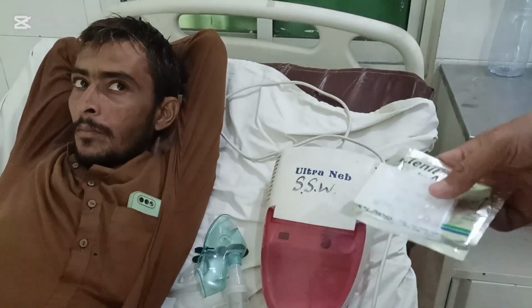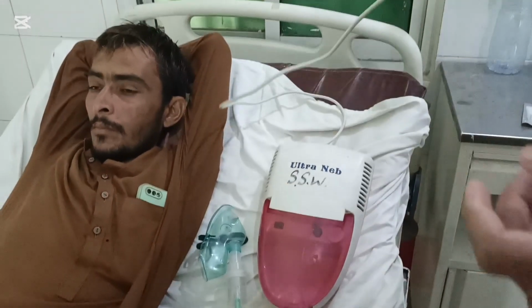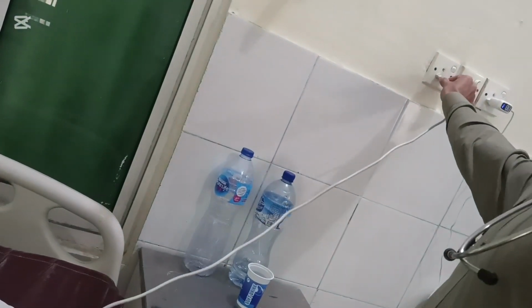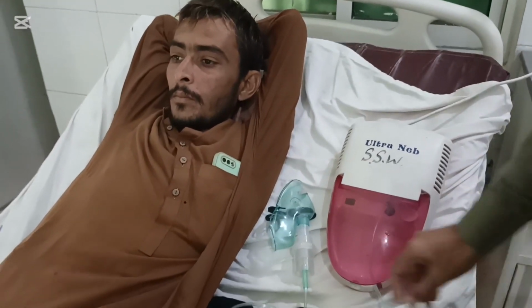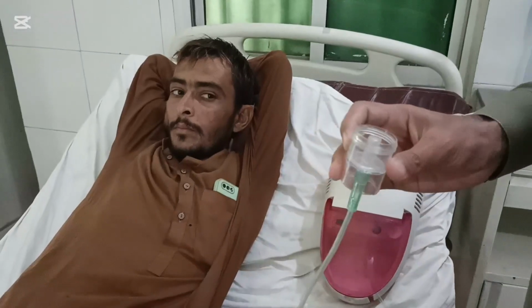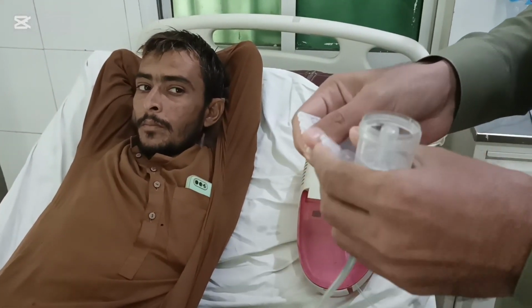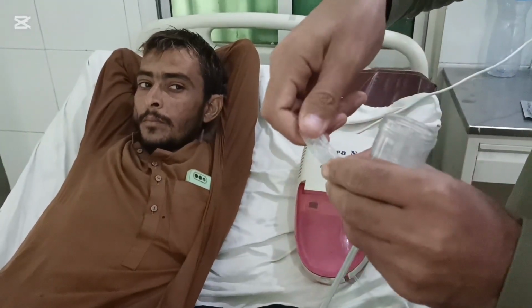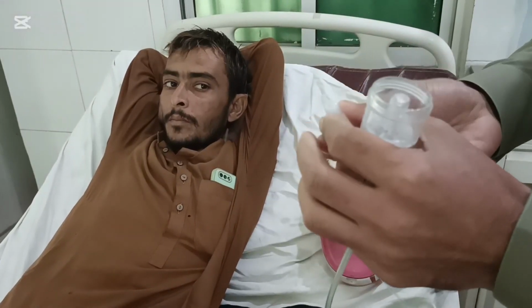So now, how to nebulize the patient? For nebulizing the patient, you have to insert the switch into the plug. So I have inserted the switch into the plug. Now this is the medication chamber, and you have to insert the medication directly into the chamber. So I'm going to insert the medication into the medication chamber of the nebulizer machine.